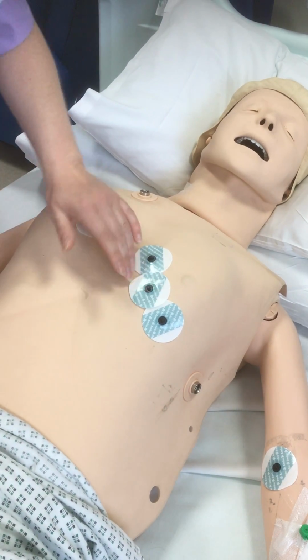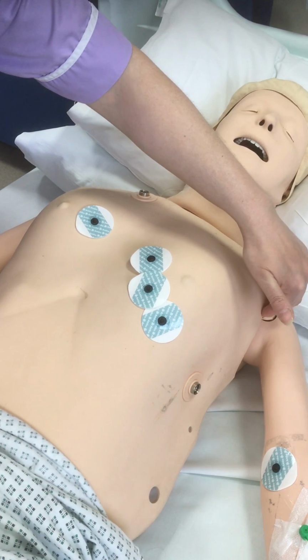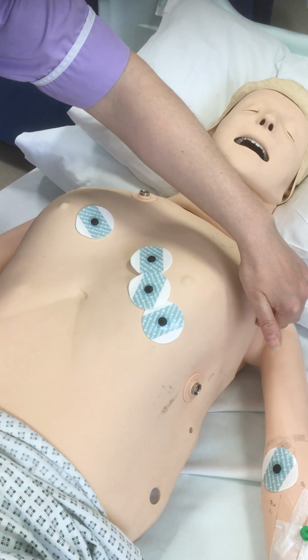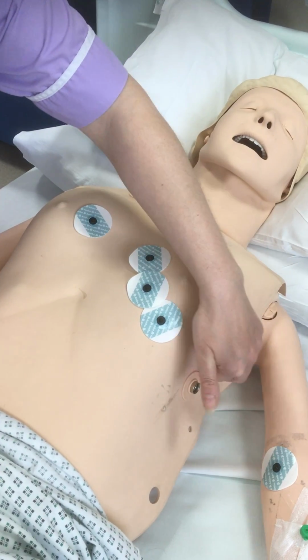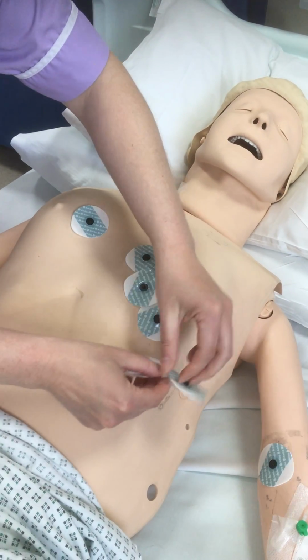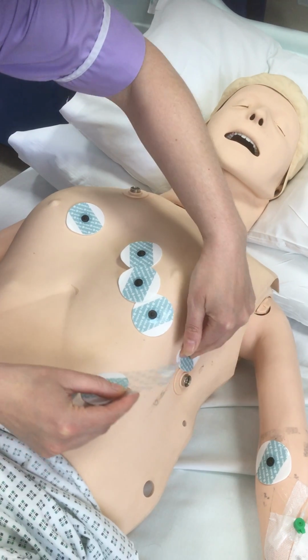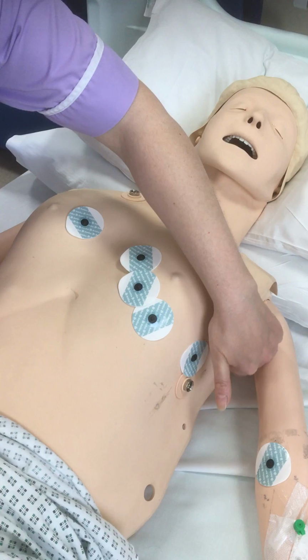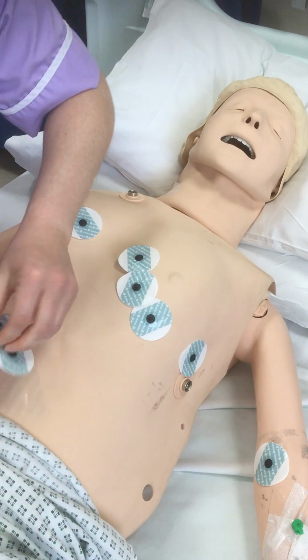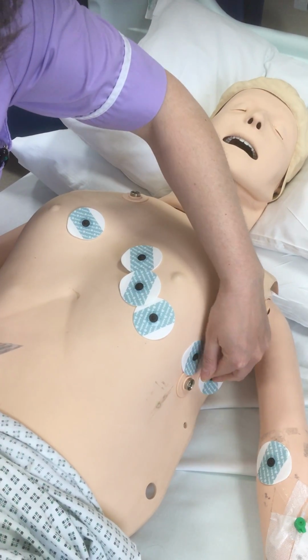V5 is anterior axillary line, which is the crease of the armpit at the front of the armpit, down to the fifth intercostal space, just there. And V6 is mid-axillary line, so mid-armpit, again at the fifth intercostal space.